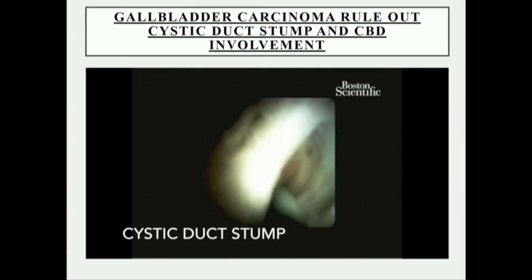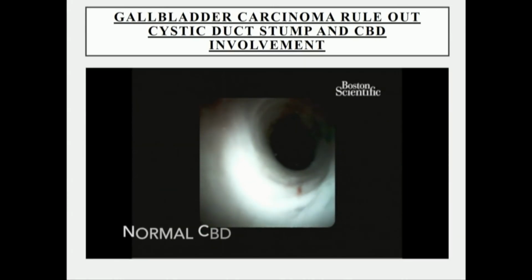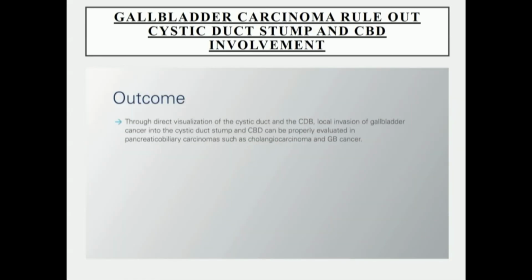These views are remarkable. I mean, there's untreaded territory that we were not able to actually look at in the past. And so you can imagine how this technology is able to allow us to confidently preoperatively stage this patient. And then we take a look at the common bile duct, and again, that's completely preserved.